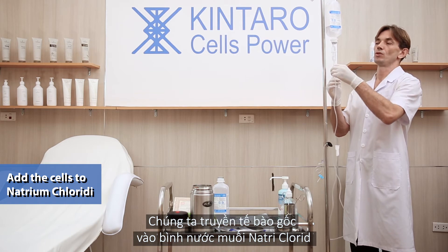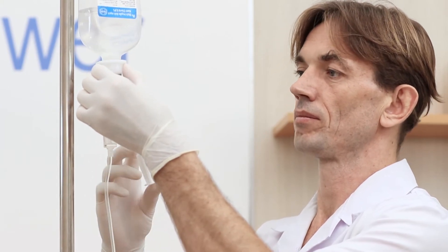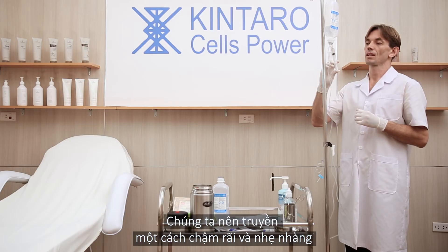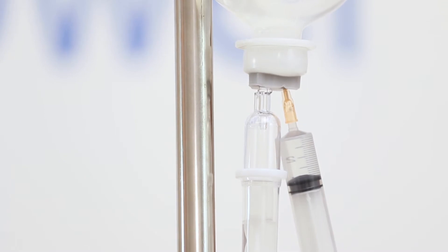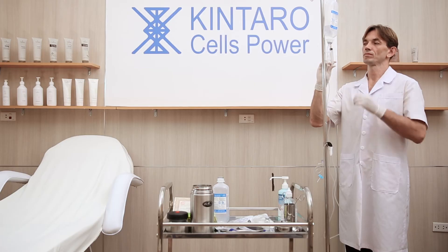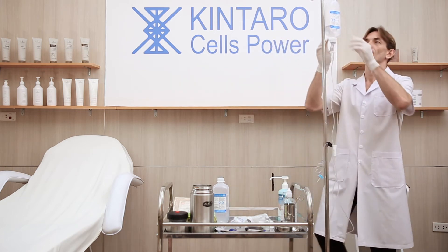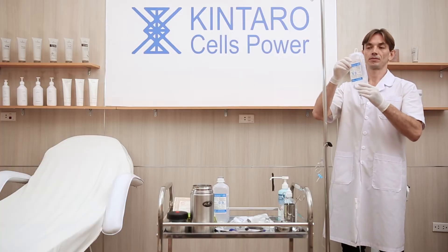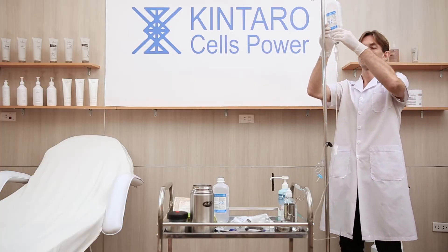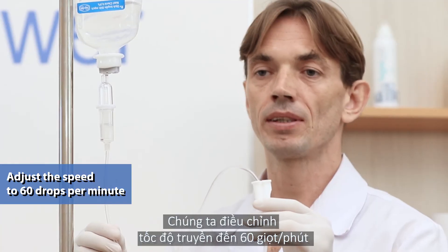We add the cells to Natrium Chloride. This should be done slowly and gently. We shake the bottle one more time slowly and gently. Then we adjust the drip speed to 60 drops per minute.